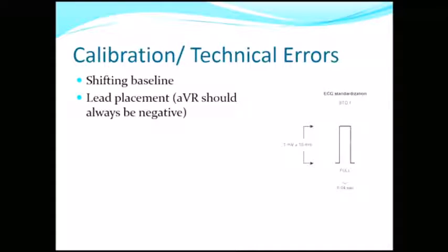All right. So before you read your ECG, you should see this calibration thing. Does anyone know why we always put this here, or why we always make sure this is calibrated correctly? So I said before that 1 big square across is 0.2 seconds, and 2 up is 1 millivolt. That's only if the ECG is calibrated like this. So if we've got a really, really fast heart rhythm and we want to slow it down, we can actually slow down how fast the ECG records, okay? And it will give us a better look at what the arrhythmia is. However, that means for example 3 to 5 small squares for a PR interval is not going to be the same, okay? So always just double check that your calibration is what you think it is.